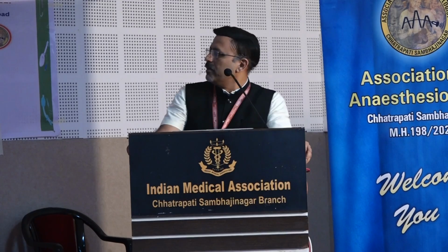You must prepare this kind of cricothyrotomy instrument set. It is very simple: take a large bore intracath, maybe number 14, attached to a 5 ml syringe and a 5.5 or 5 number endotracheal tube adapter to it. They are very, very helpful in OT, and this must be kept in all OTs which deal with unanticipated difficult intubation.